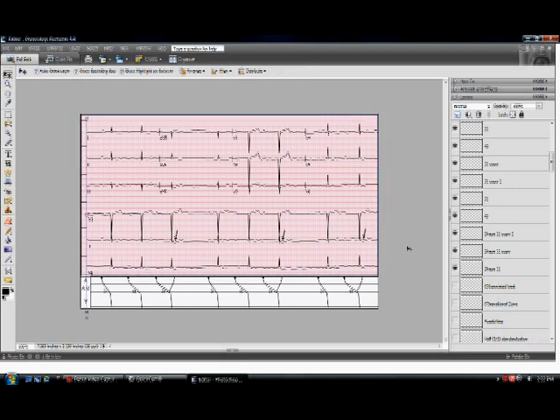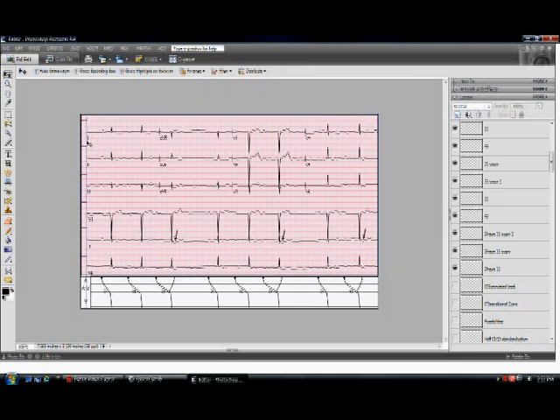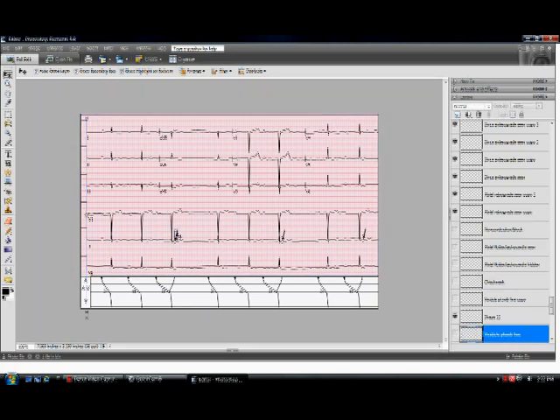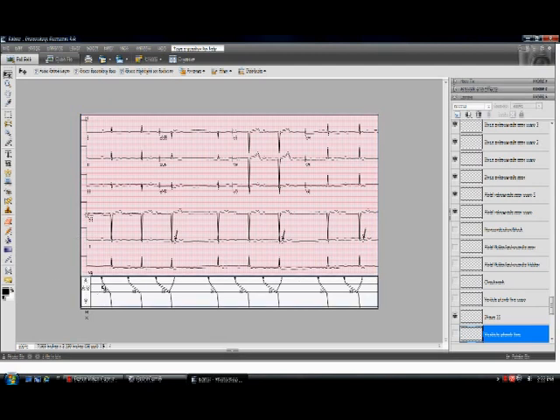And this will be the final version that I would display on the internet. Arrows pointing towards the retrograde P-waves in lead two, progressively lengthening PR intervals.